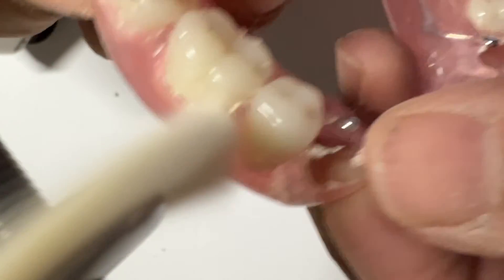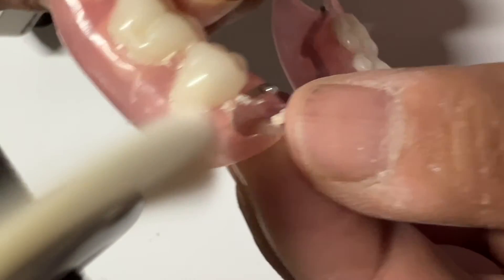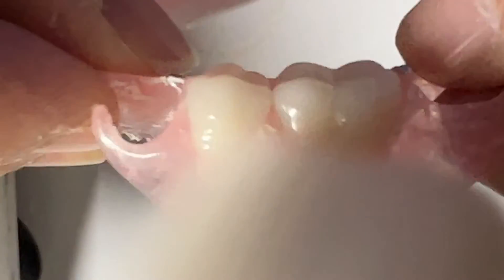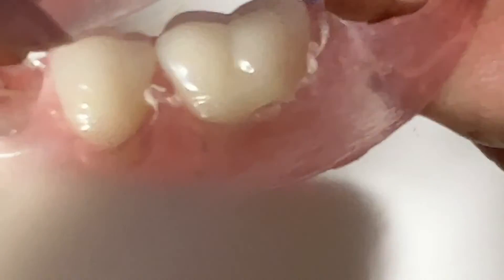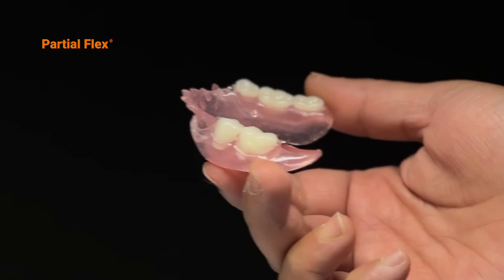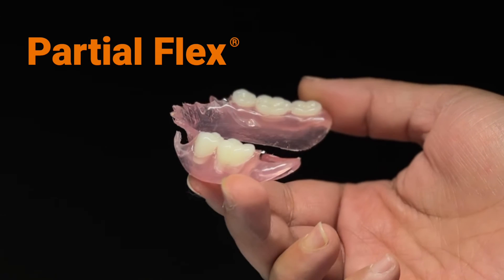Begin buffing with a white brush rotary bit using firm up and down strokes. Finalize the polishing process with a Muslin pad rotary bit with fine buffering — up and down strokes and ready! Flexibility in good hands. Partial Flex!